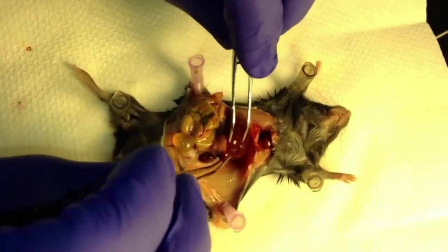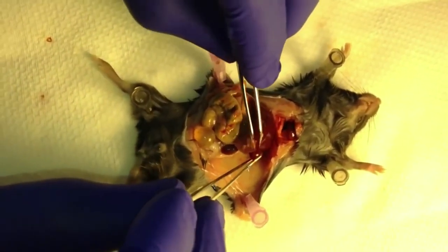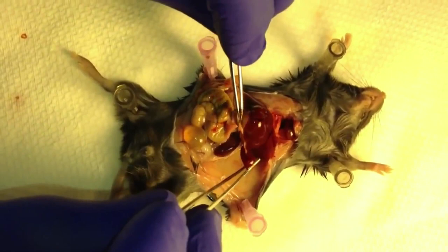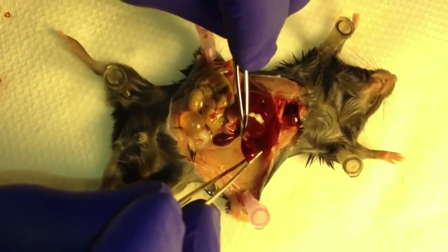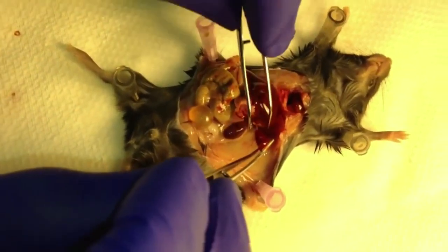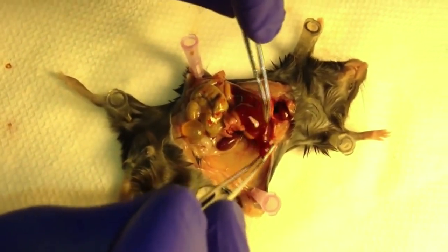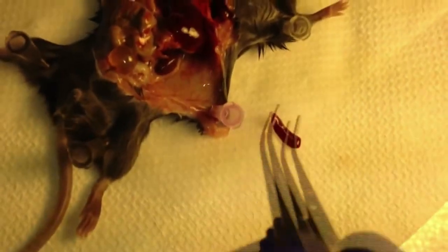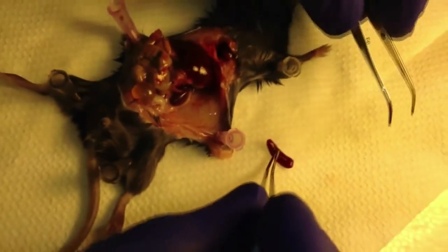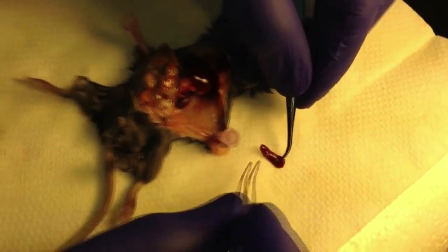Okay, so now you take the spleen out, and you pull the fibers off, and you do this slowly so that the spleen doesn't rip, because even though it's pretty firm, it can still rip. Okay, so now I've extracted the spleen, and I'm going to make sure that there's no remaining fat or fiber.